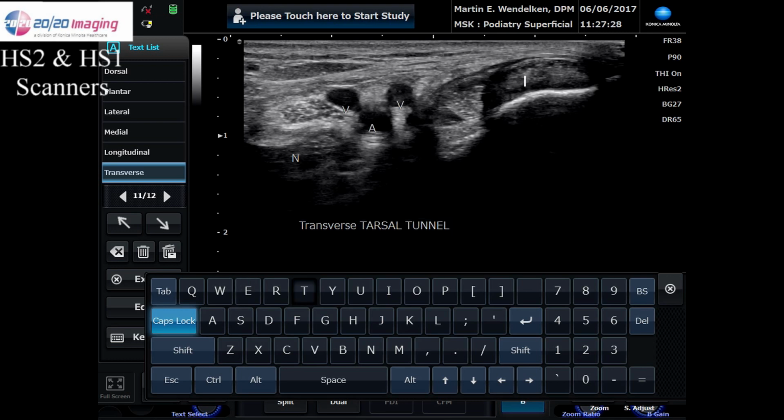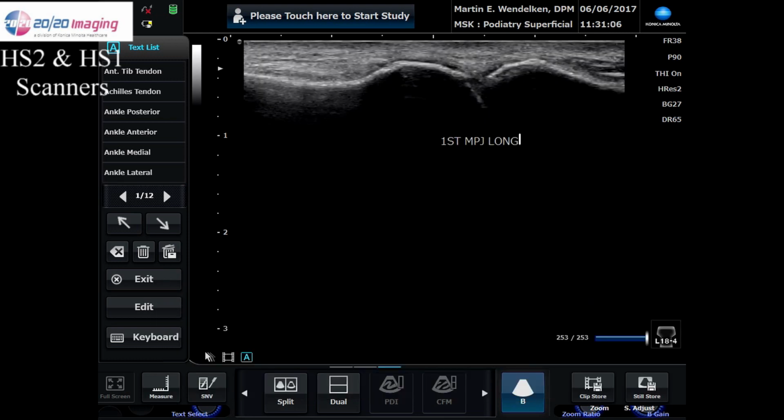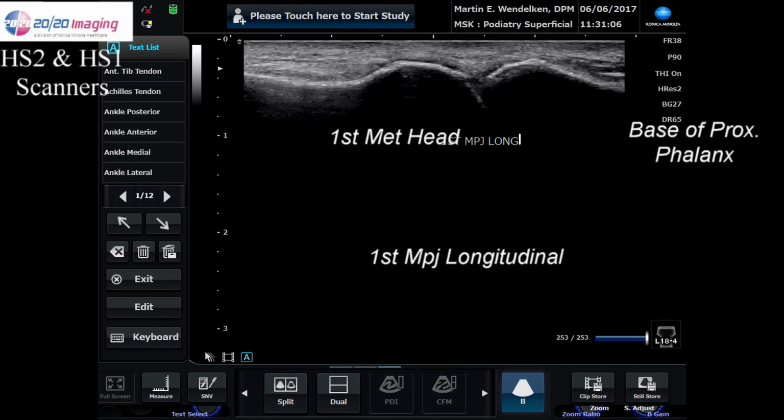particularly pay attention to the white structure to the left. That's the posterior tibial nerve. Those little black dots are actually the fascicles of the nerves. You see the PT tendon, flexor tendon, and the artery, vein, and nerve. I think you're starting to see how great the image quality really is.